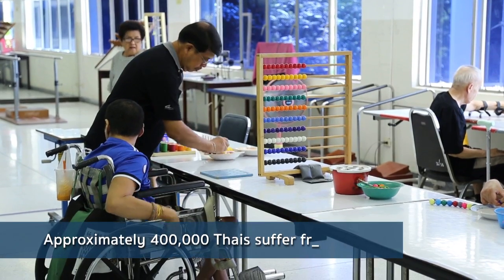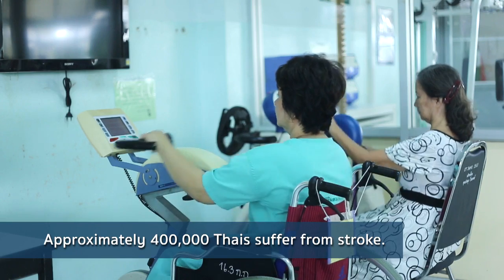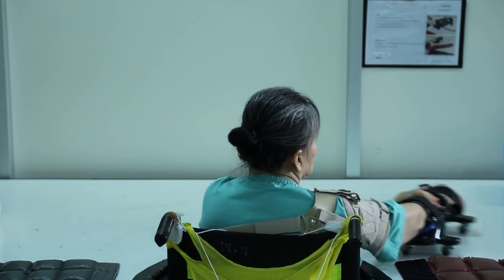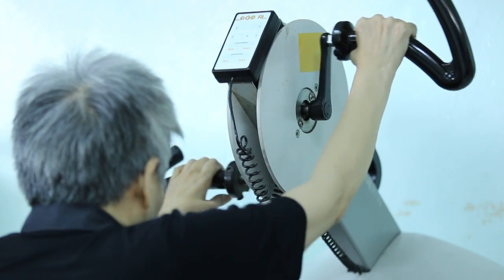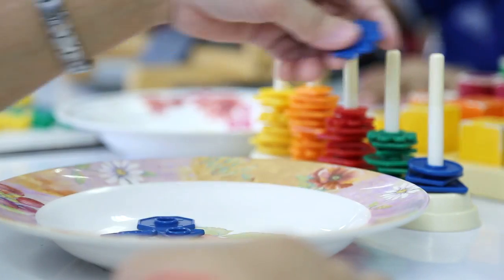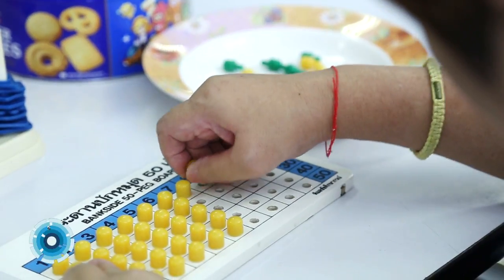There are at least 400,000 stroke patients in Thailand suffering from movement disorder. These patients have to go through a rehabilitation program in order to regain their motor movement. A typical hand rehab program is to pick up an object and move it around. The problem is that this kind of rehab is not motivating — sometimes patients get bored and give up. So we came up with an idea to help them.